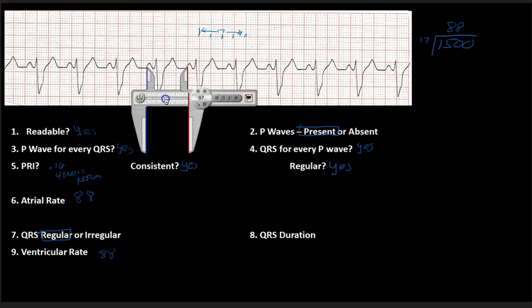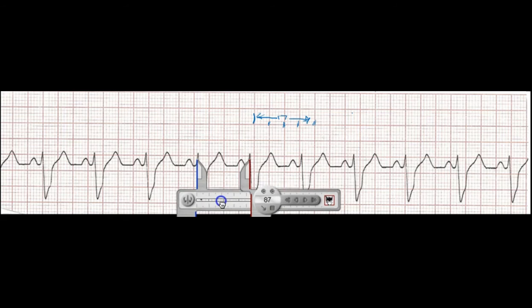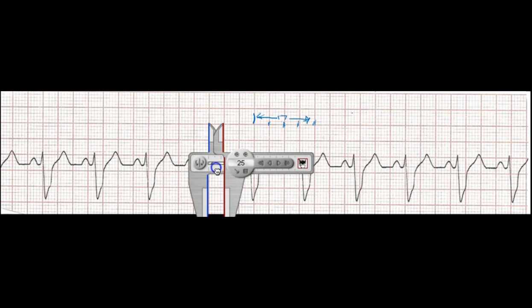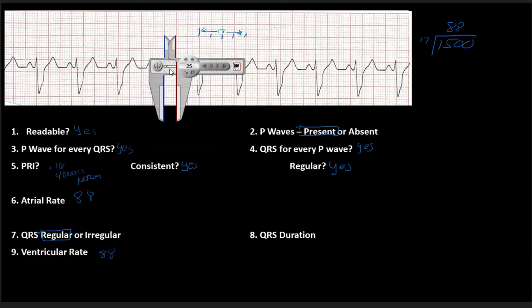Now I need to look at my QRS duration. So here's where I started, or here's where I left off with my PR. And I'm going to come into about right here. And when I move this, I notice that I am about four blocks, right? So I'm about four blocks in width. So my QRS duration is here greater than 0.12. So when I look at this, everything is normal with the exception of the QRS duration. So this is the abnormality.